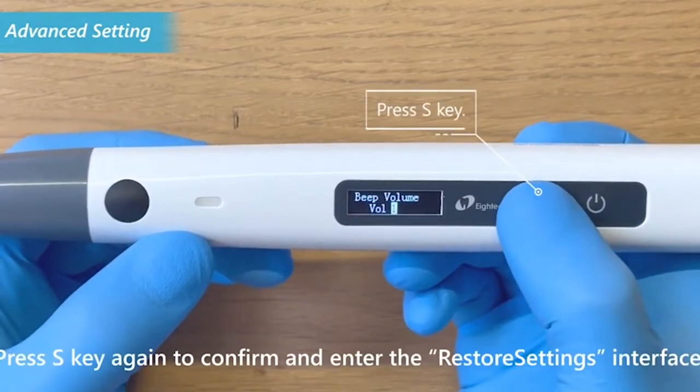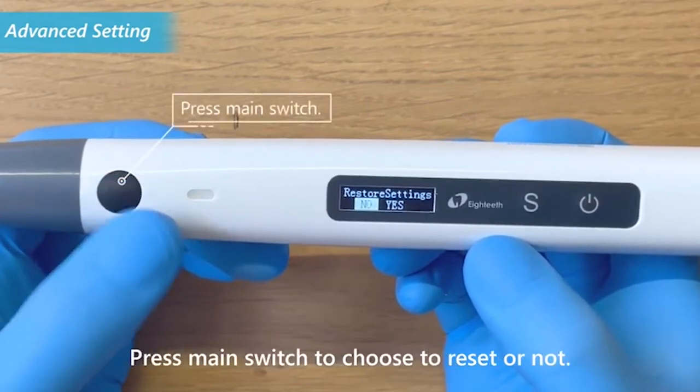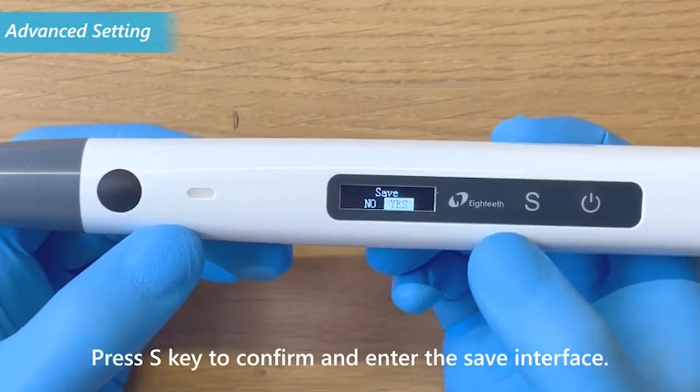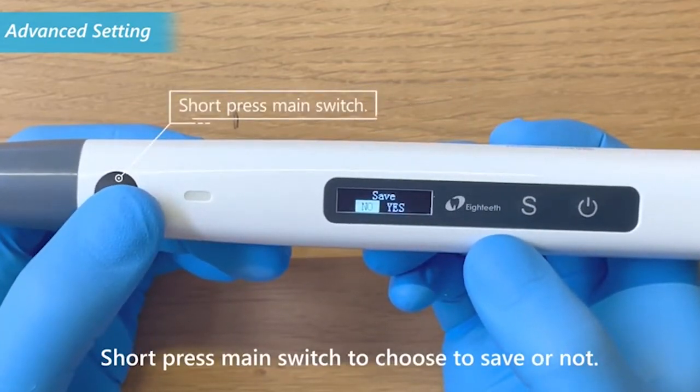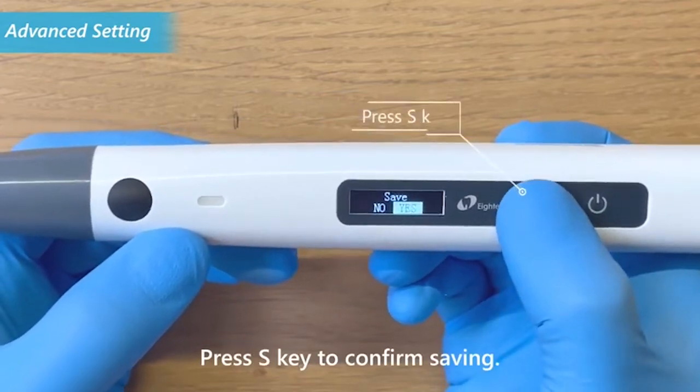Press the S key again to confirm and enter the restore settings interface. Press the main switch to choose to reset or not. Press the S key to confirm and enter the save interface. Short press the main switch to choose to save or not, then press the S key to confirm saving.